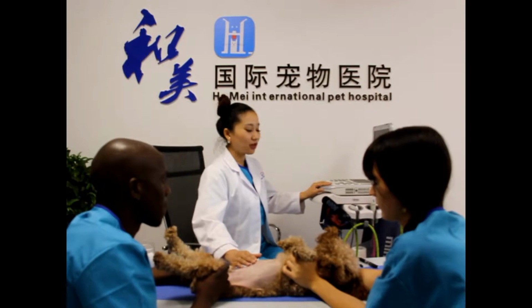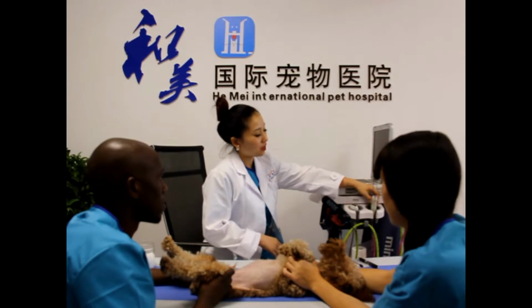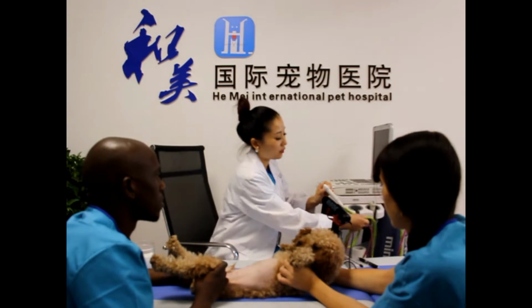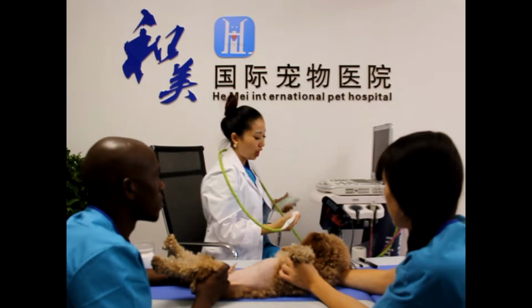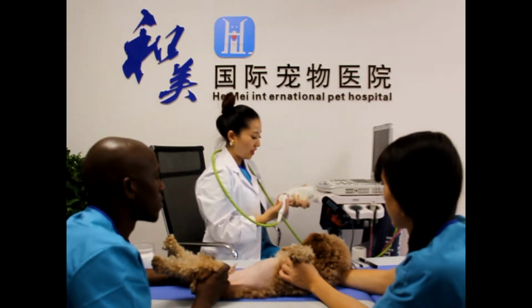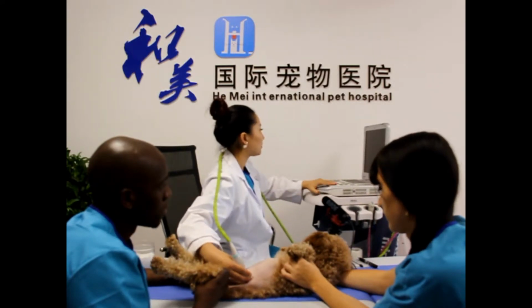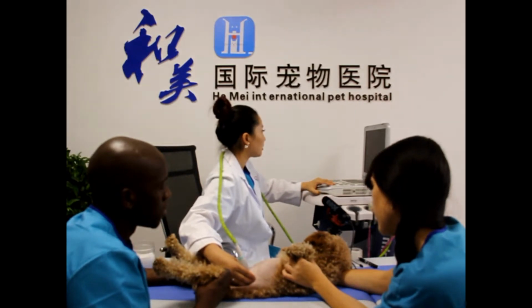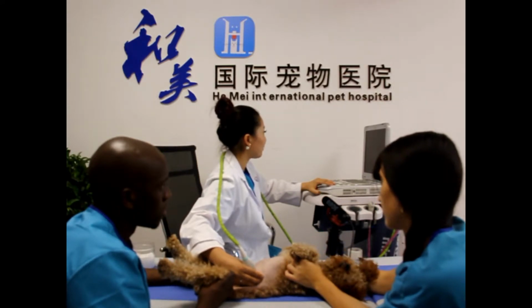So now I will show you how to find both adrenal glands. Normally you can start with the low frequency transducer, but here I would like to choose the high frequency transducer because the dog is so tiny. First I will show you how to find the left adrenal gland. First, we find the left kidney as the first landmark. Here is the left kidney.